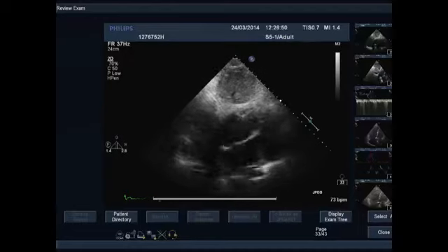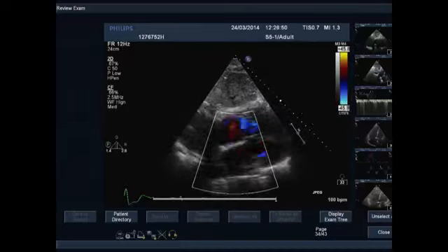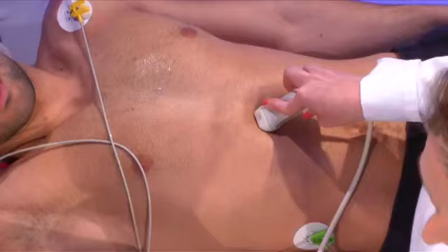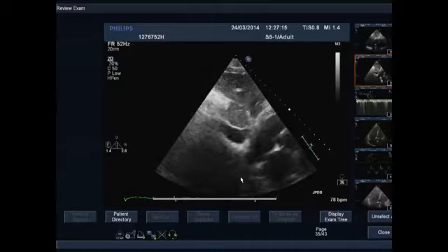Furthermore, most important, we will assess the continuation of the right atrium to the inferior vena cava. A significant measurement will be the right atrial pressure, and it is important because it will also add to the maximum gradient to assess the right ventricular systolic pressure of the patient. In order to assess the right atrial pressure, we use the diameter of the inferior vena cava and the respiratory collapse, and we might need to tell the patient to sniff in order to see whether there is any respiratory collapse of the inferior vena cava.